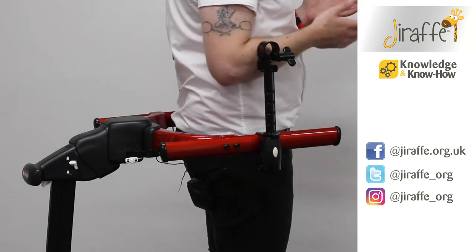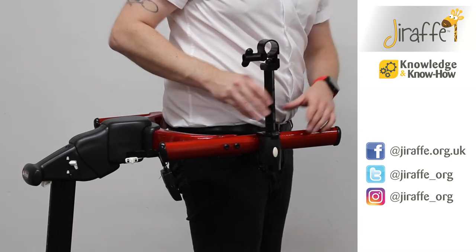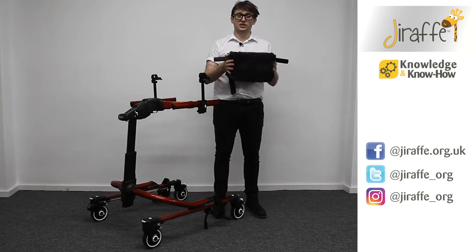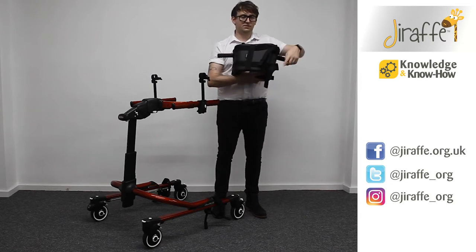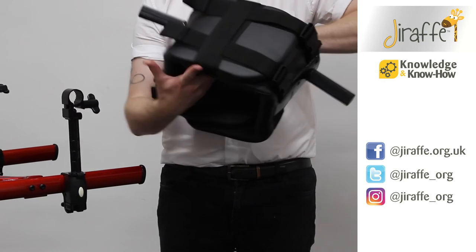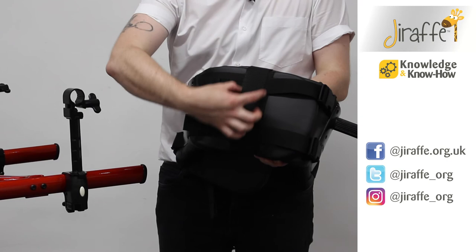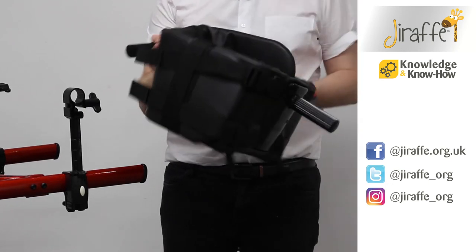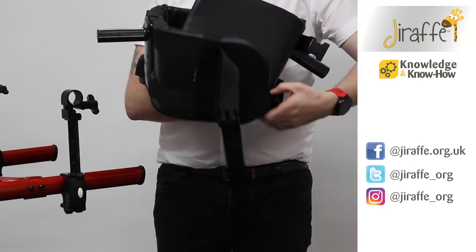If you're going to be using the frame in a posterior fashion, then we need to turn the fitting the other way so that the wing knob is facing behind the client. Before we fit the chest prompt, a few things to note. We have four clips on the chest prompt itself. On the front section of the chest prompt we also have a strap that goes down the middle — that tells us that this is the chest section, and when we open up the back we're able to gain access.